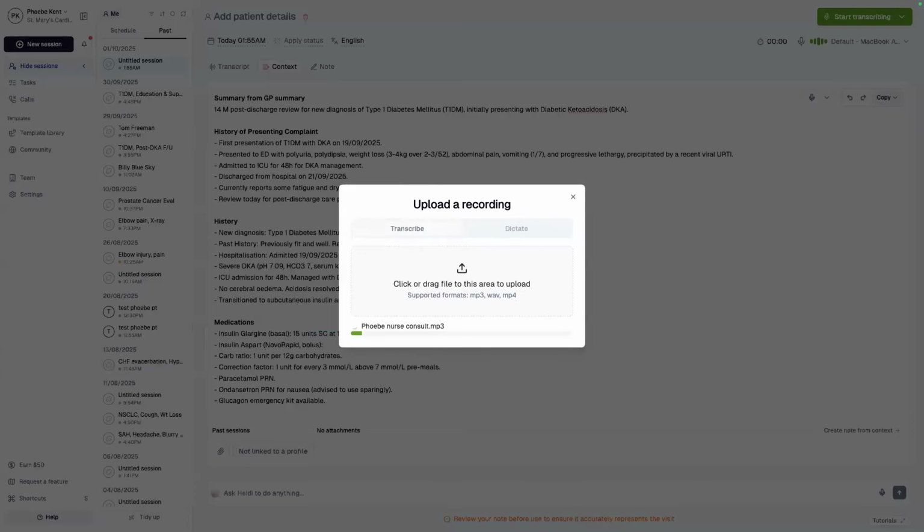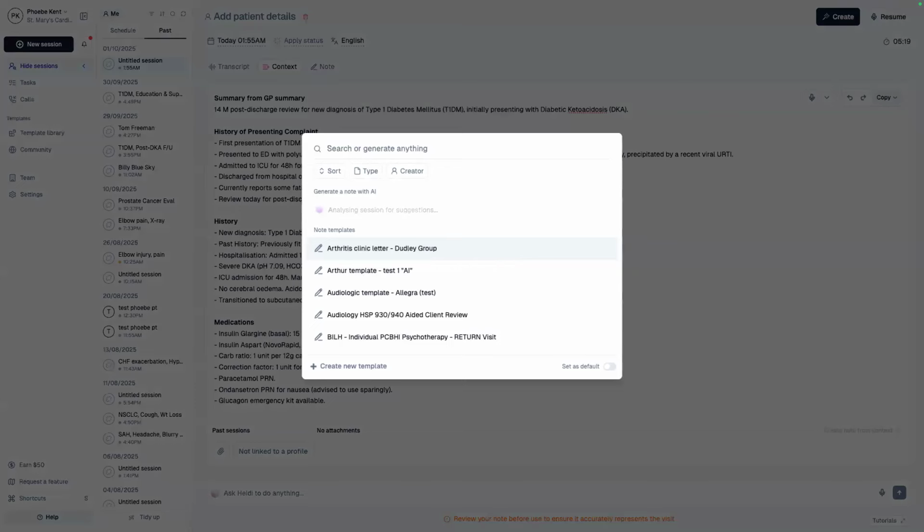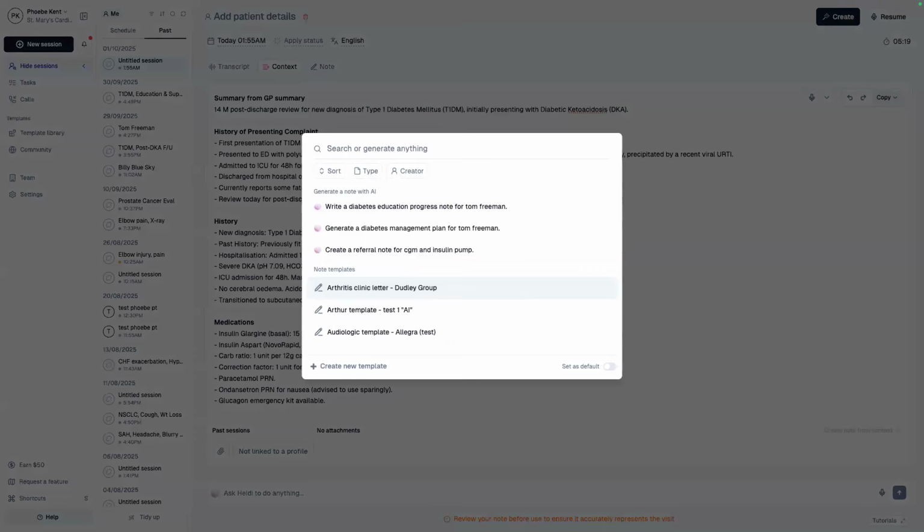While you're uploading that and generating that first note, I might quickly answer a question from David about what you say if the patient asks where my discharge letter is stored, and he's UK based. All of the information kept in Heidi, if you're in the UK, is stored locally in the UK on private servers there. If you're in Europe, we have servers in Frankfurt, which service all of Europe and also South Africa for our South African users.